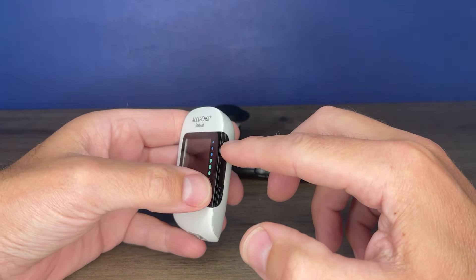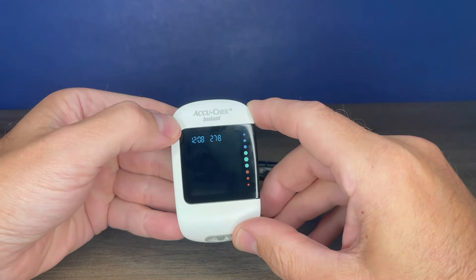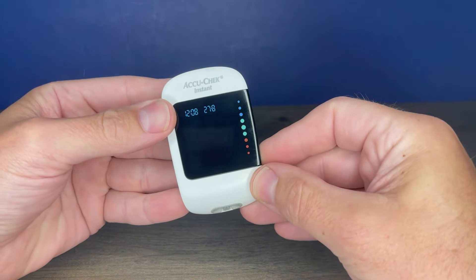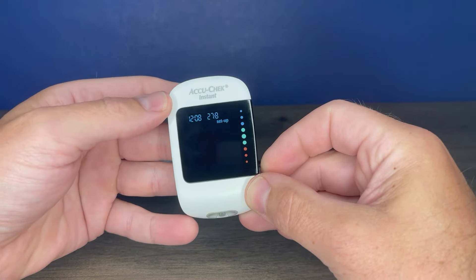When you first get your meter, you want to press the up arrow button to power on the meter. It will default to setup mode the first time you turn it on. If you'd like to re-enter setup mode, you just press and hold the bottom arrow and it takes you into setup mode.